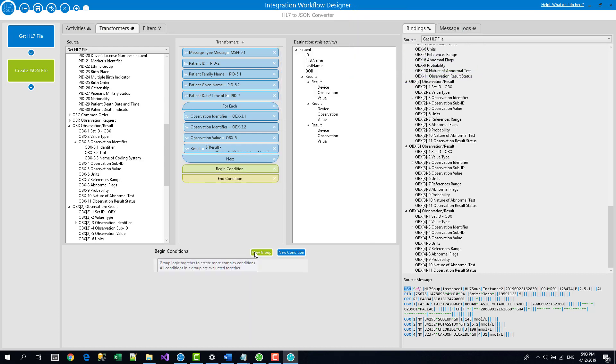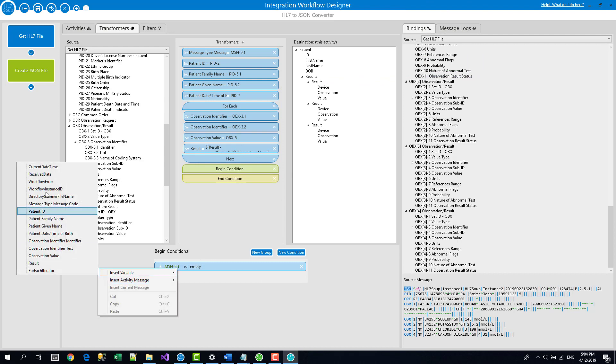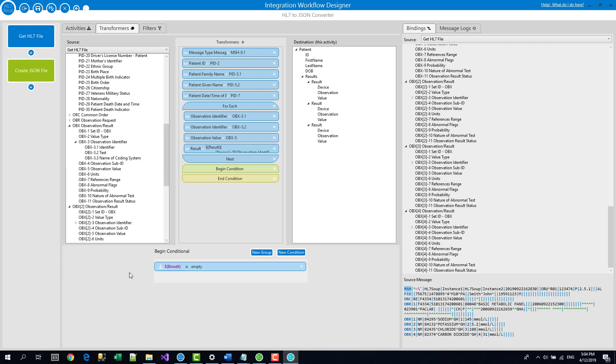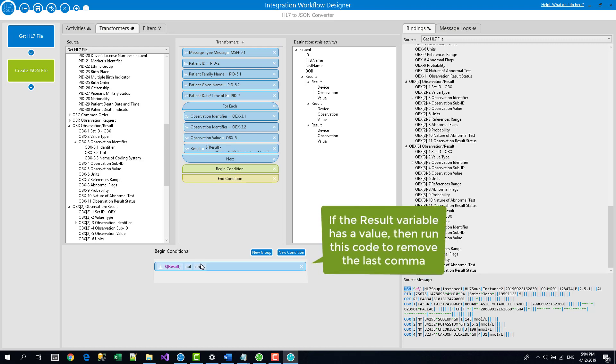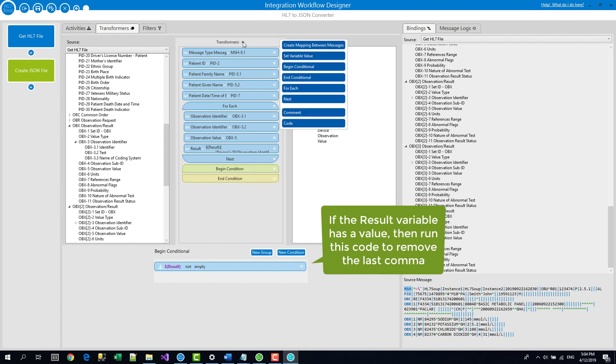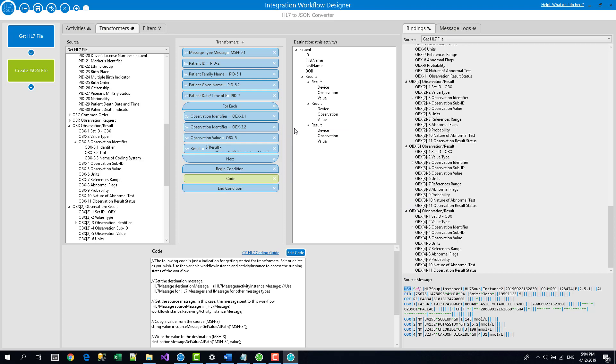So what I want to say is I'm going to do a new condition and say if the result is not empty, because we don't want to do this if there was no result records. If the result is not empty, run some code. So we will insert some code. Okay, now it's giving you a whole lot of code by default. This is just sample code. If I click the editor, it's a bit easier to read.